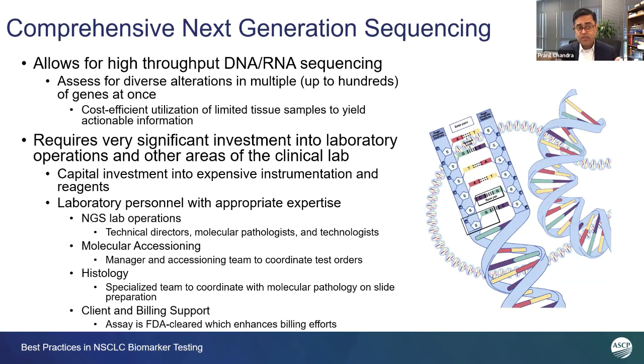So it actually results in cost efficient utilization of limited tissue, and tissue samples can be very limited in the context of lung cancer. And the goal is to yield as much actionable information that is going to help drive therapeutic decision making, but there's also diagnostic and prognostic information that comes from next generation sequencing.